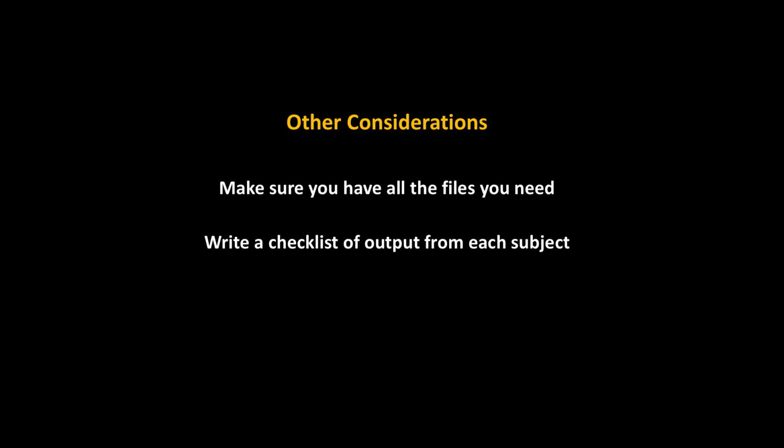Did it seem like they were moving a lot? Did they have any complaints? Did we miss a scan for whatever reason? Sometimes there's a hiccup with the scanner. Something happens. You need to make sure that you know exactly what subject has what data and why they do. And this will save you so many headaches down the line.